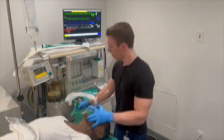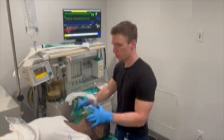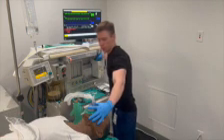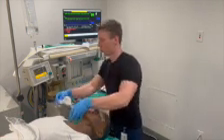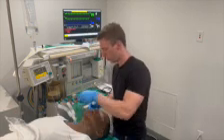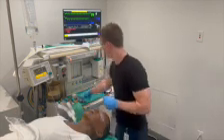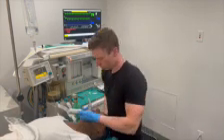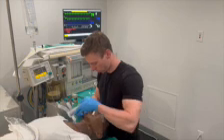It is now time for direct laryngoscopy. Turn off the anesthetic gas, remove the mask and oral airway, and gently extend the neck. Some providers scissor the jaw open by touching the fingers to the molars. Others prefer to cradle the occiput and allow the mandible to open passively. Whichever method is utilized, just ensure that there is adequate mouth opening.